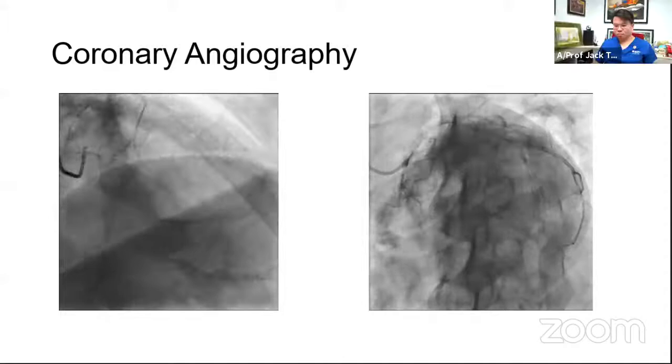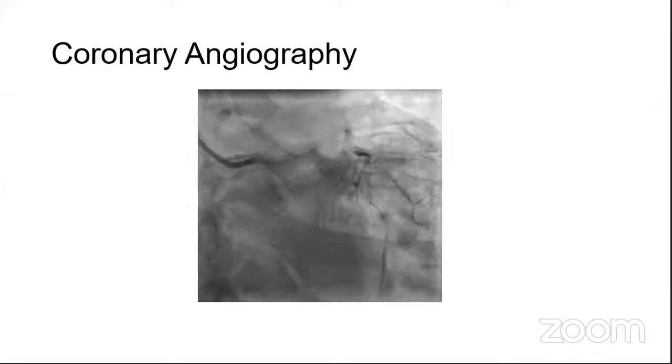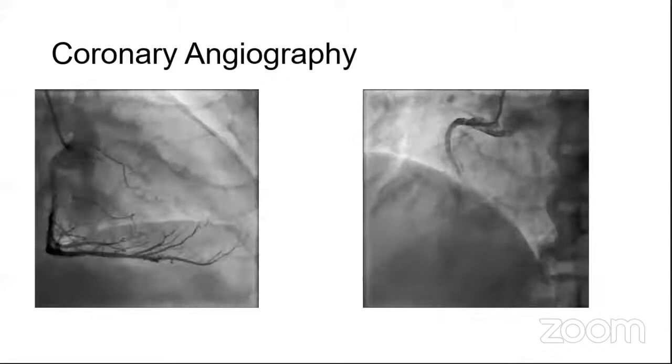Show the next view. Now, this is the AP caudal, and on the AP caudal, you can very well appreciate that the distal left main is tight, about 70% tight, but definitely looks significant on this view. So what we know for sure is that there's a lesion in the proximal circ. The ostium of the circ also looks tight, and the distal left main looks tight. Ostium of the LAD looks hazy, angiographically not very tight. So provisionally it was Medina 111 or 101.